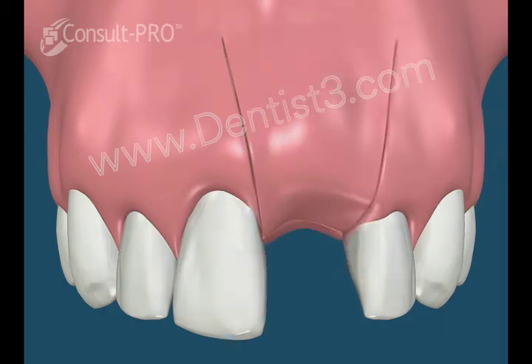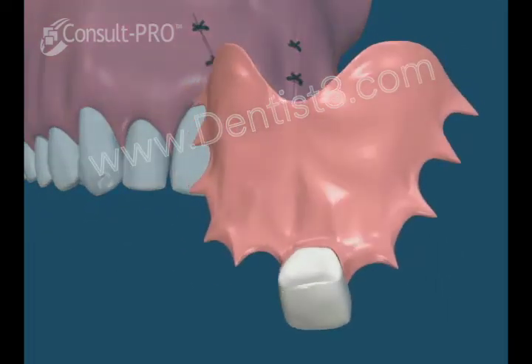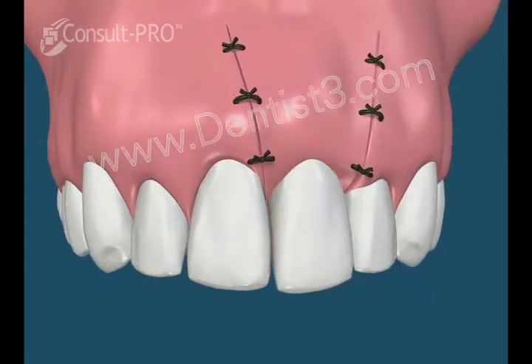The flap is repositioned and sutured into place. A provisional denture can also be inserted at this time to temporarily replace the missing tooth during this healing stage.